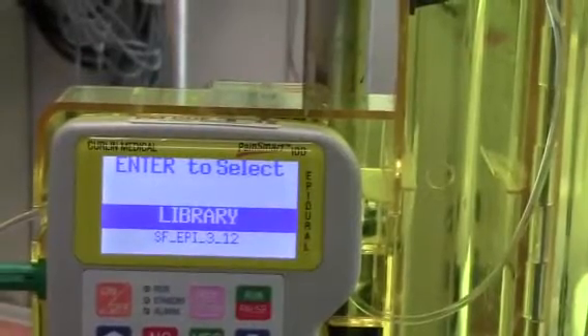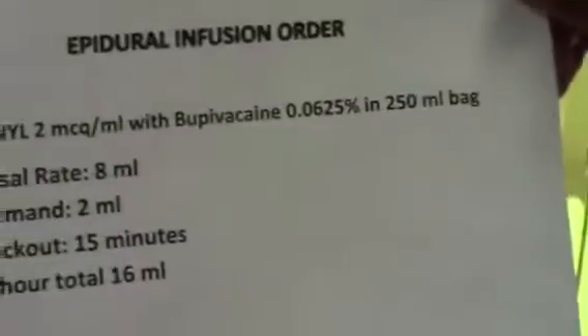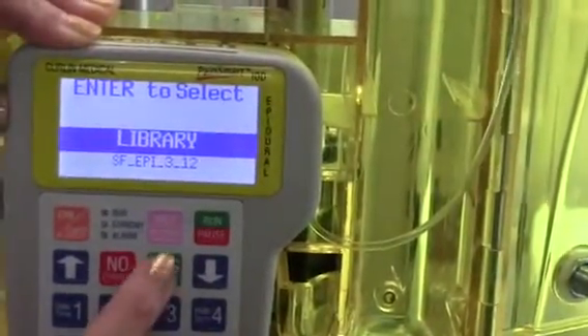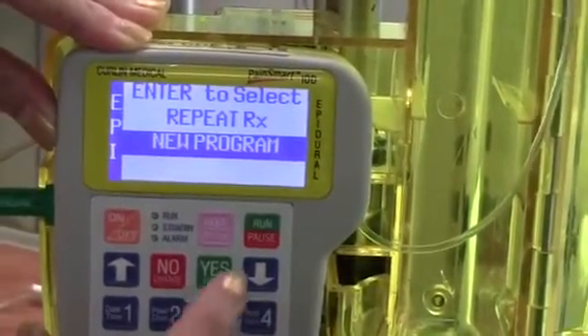If you notice, you're going to see on the screen: library. At this point, you should consult your doctor's order so that you can select the correct library with the correct dosage. So we're going to press yes, and we're going to go to new program, yes.